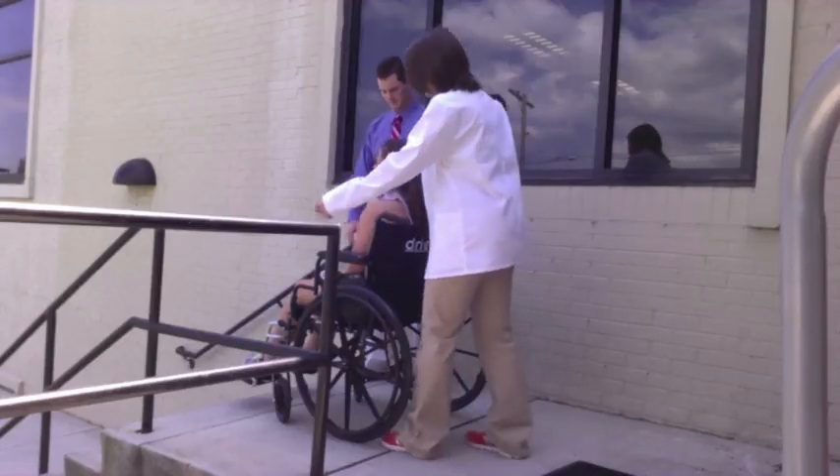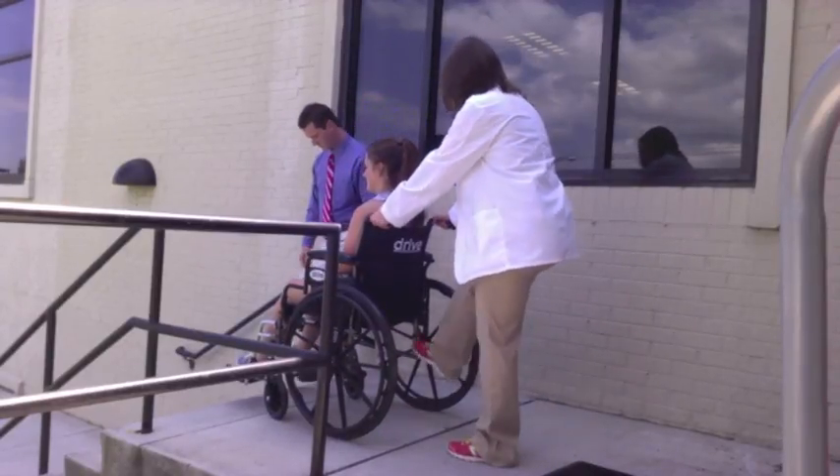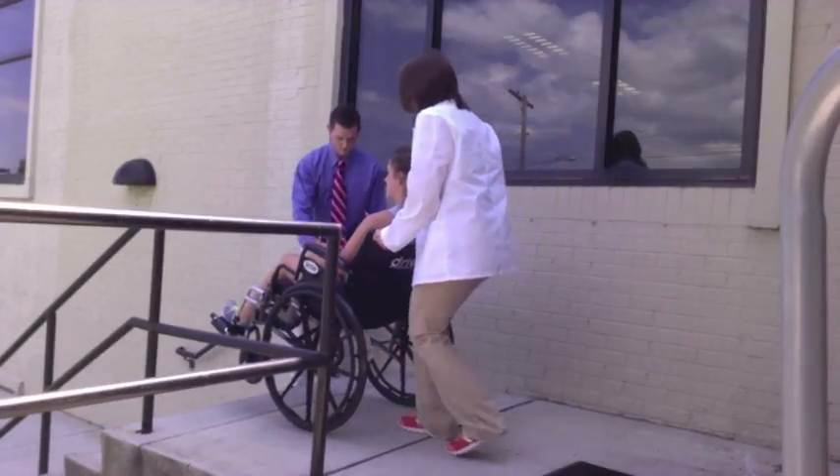With the locks disengaged, the clinician tips the wheelchair back into the wheelie position, elevating the casters. The wheelchair must be maintained in the tip position as it moves down the stairs.